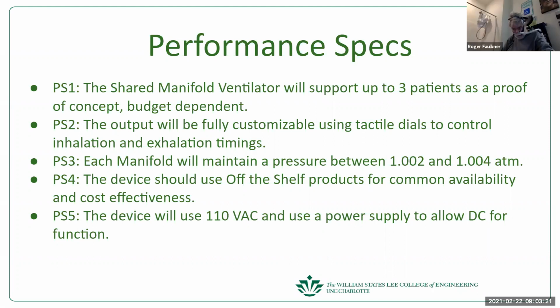Well, the standard pressure regulator on an oxygen tank allows you to set a pressure. It's not super accurate, but I'm just saying, the regulator itself should be adjusted so that it can be counted on to give a pressure that's just above.